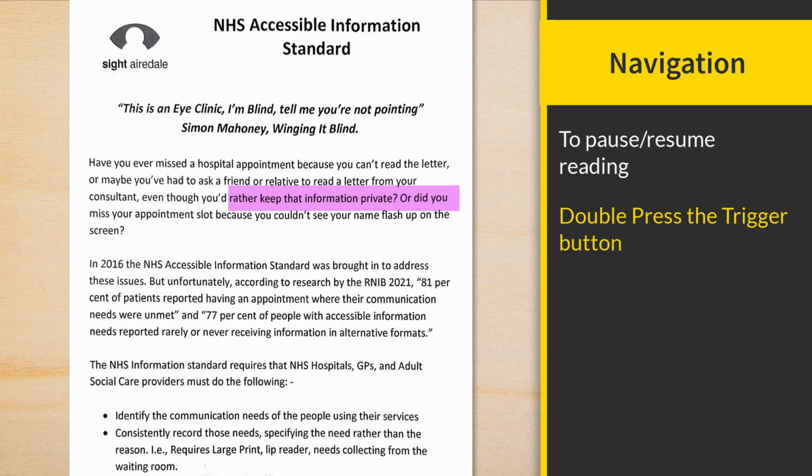Rather keep that information private. Or did you miss your appointment slot because you couldn't see your name flash up?